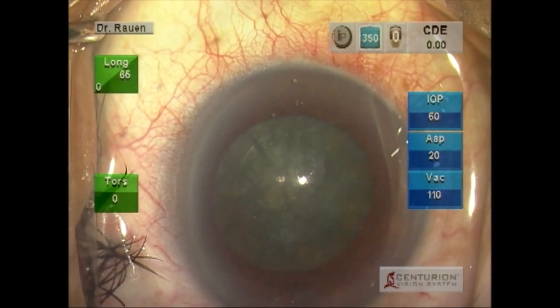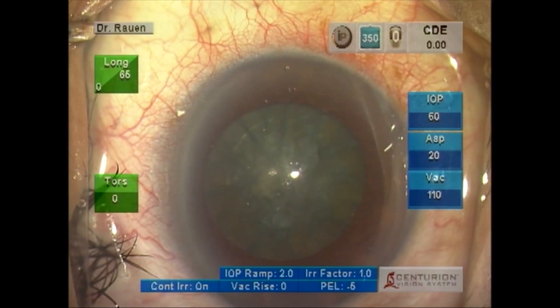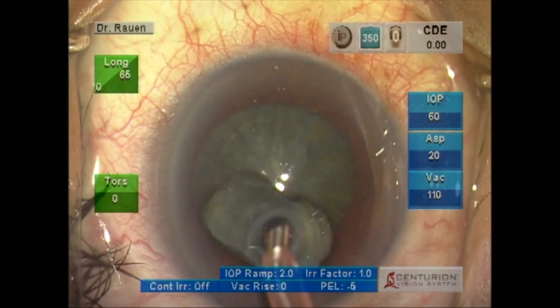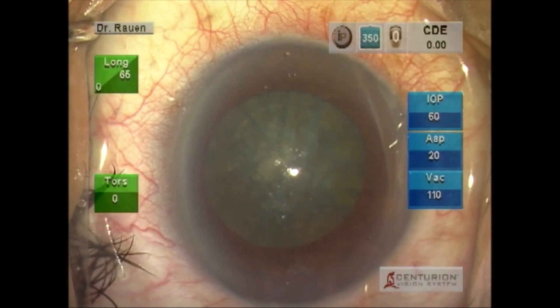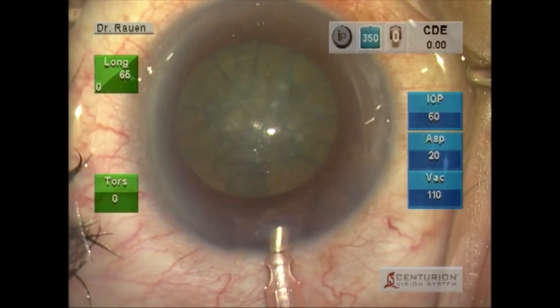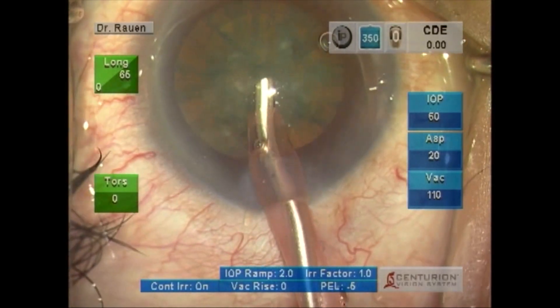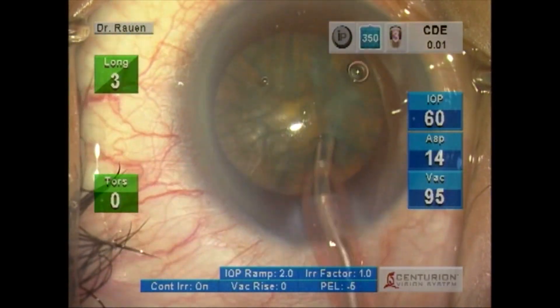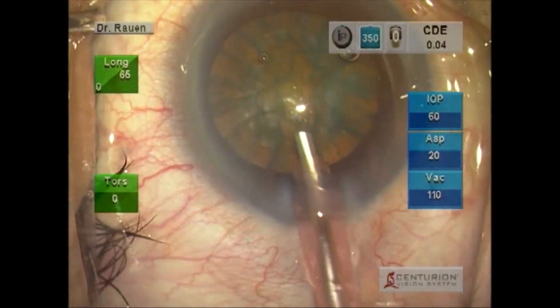We then follow up with capsulorhexis and hydrodissection, and you'll see us introducing the phaco handpiece. This is an example of the 30-degree tip, and one of the beauties behind this new system by Alcon is the efficiency with which it removes nuclear material.